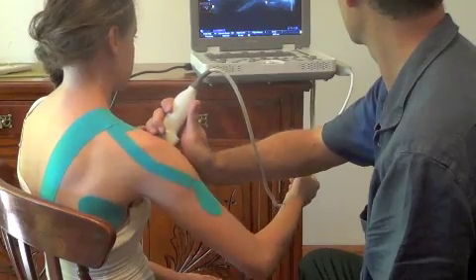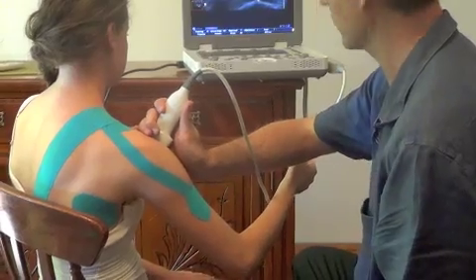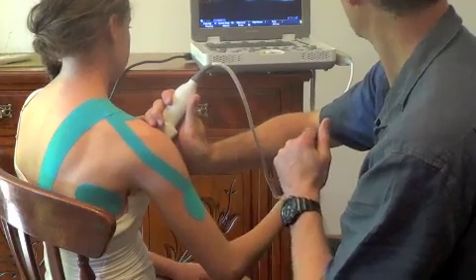Also, you can tape the shoulder to facilitate correct activation patterns and reassess if the bursa and/or tendon is still impinging with functional activities.